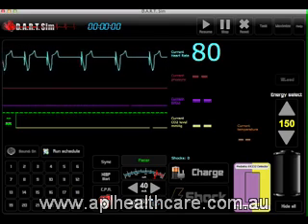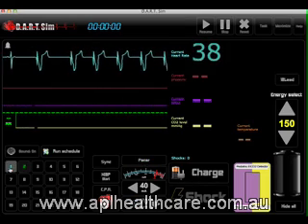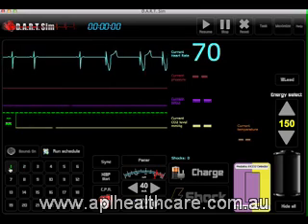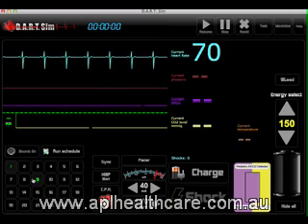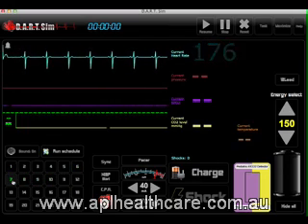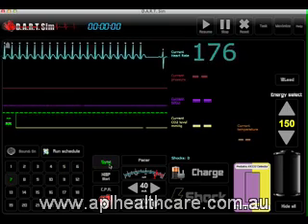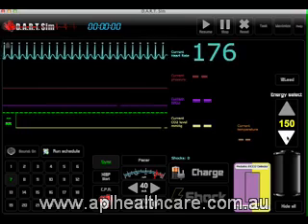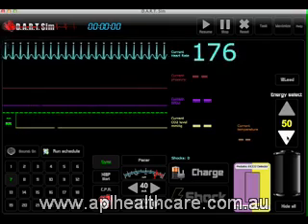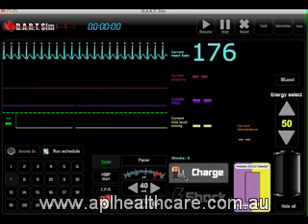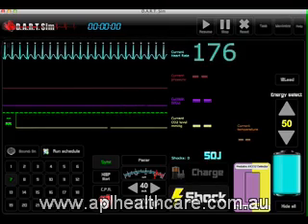We also have synchronized cardioversion. Simply tap on the sync button there, and then you can select your joules here. You can charge and give a simulated shock.